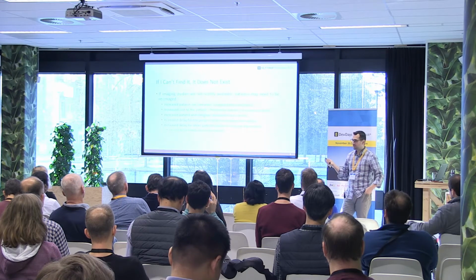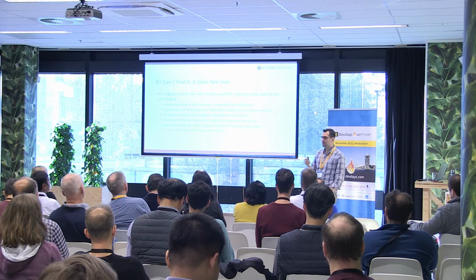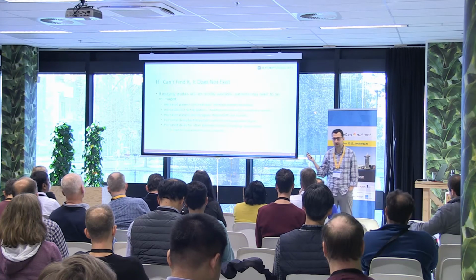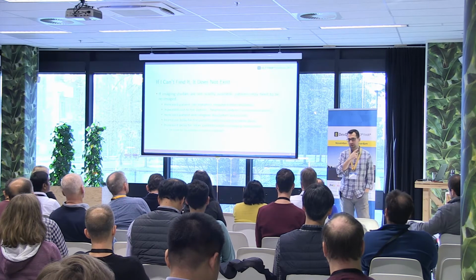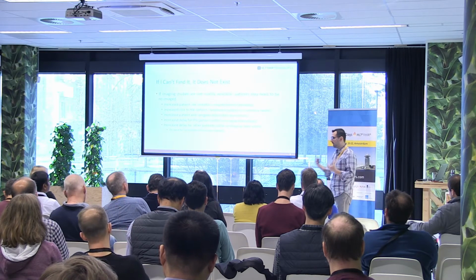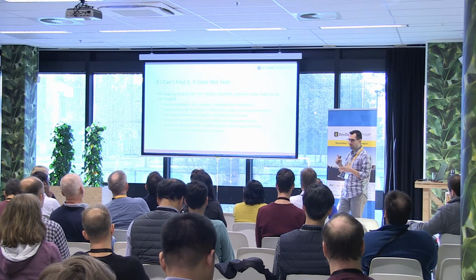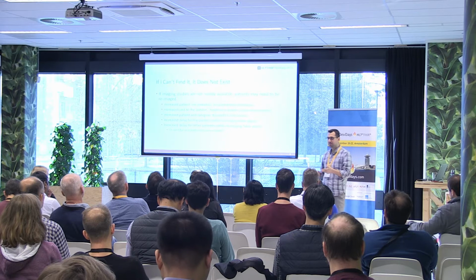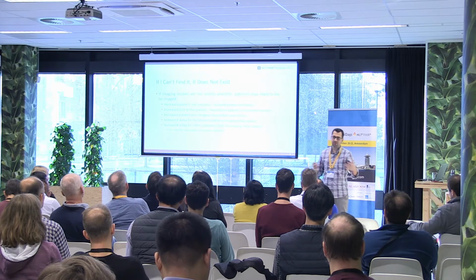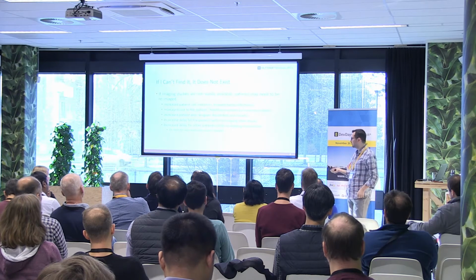And of course, the other problem with managing images is what happens if you have had your X-ray taken at hospital A, and now you're getting treated at hospital B, and the two don't talk to each other, and now they have to repeat it. So now you're being exposed to radiation, your healthcare is experiencing delays, and if you're there with loved ones, the loved ones are probably getting annoyed because this is getting too much, and so on and so forth.